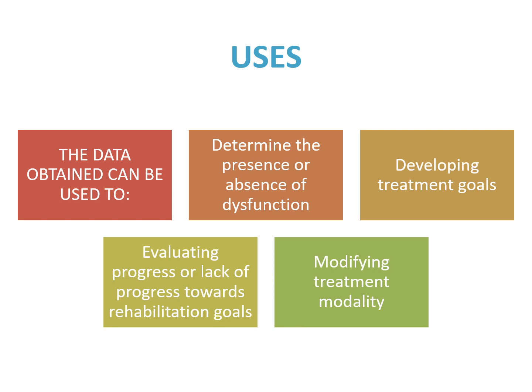Next, you can evaluate the progress. You can check whether your patient is improving or not. If you have the pre-recordings, the pre-range of motion of the patient, after a few sittings of physiotherapy, you can compare the previous range of motion and the current range of motion of the patient, and that will help you in understanding whether you are moving in the right direction or not, whether you are improving anything in the patient or not, whether you want to change the protocol, whether you want to increase the exercises or reduce the exercises.